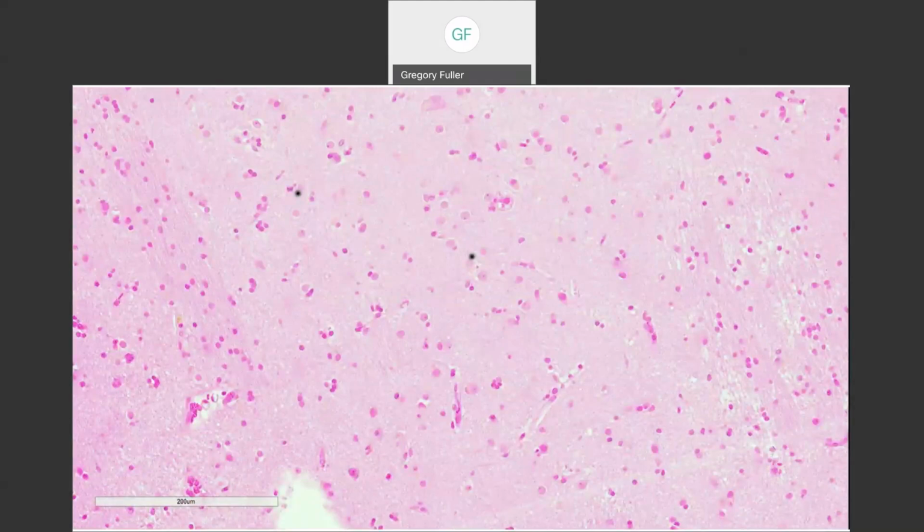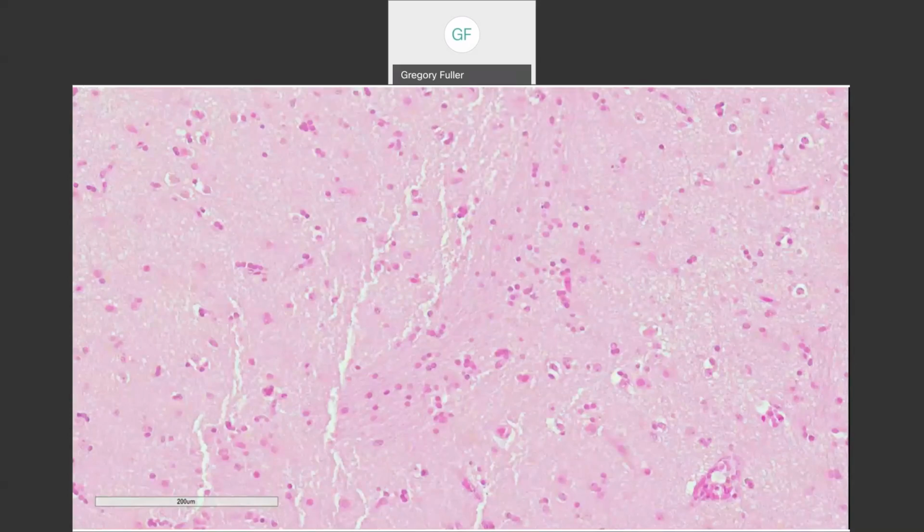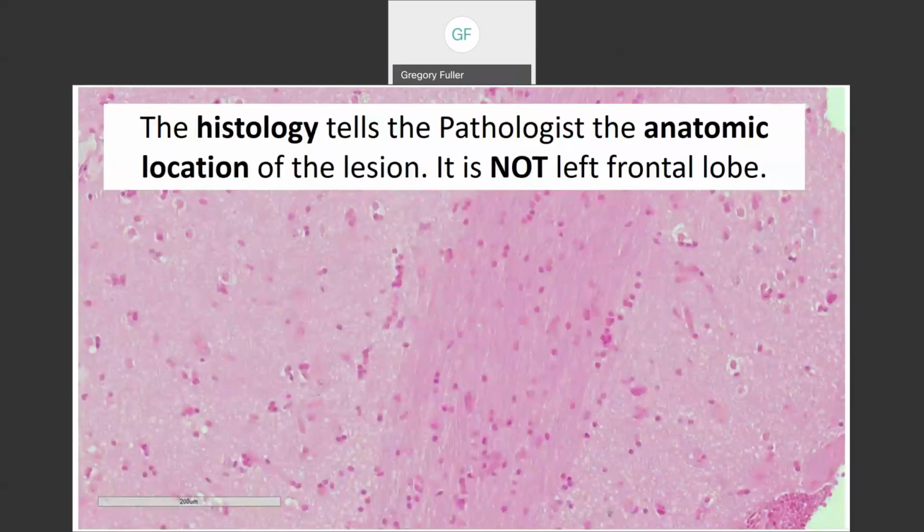This one is really subtle, and there's some edema separation out here, but that is a Wilson's pencil. It would light up with a Luxol fast blue stain. All right, here's another one. See this guy right here? That is a Wilson pencil, completely surrounded by gray matter. You don't find that essentially any place except for the basal ganglia, right? The striatum, lenticular nucleus, globus pallidus, etc.